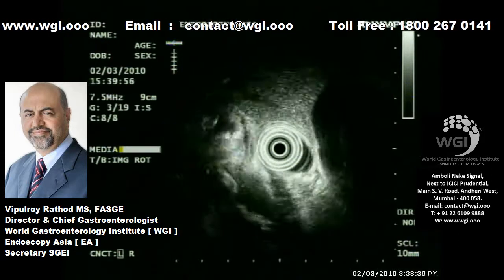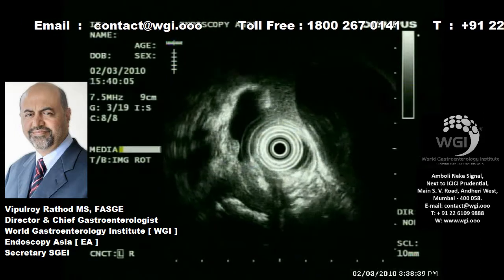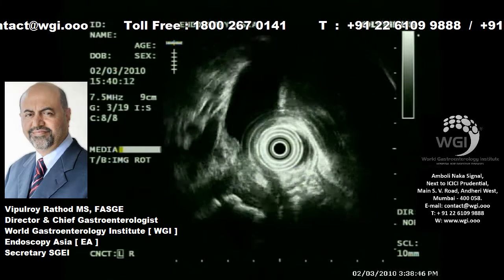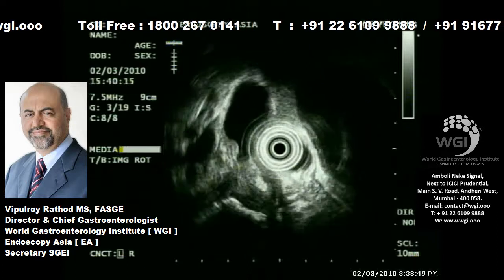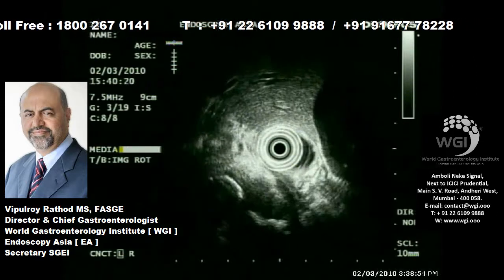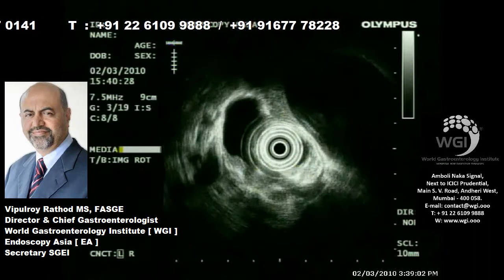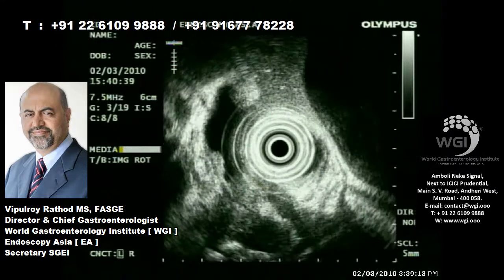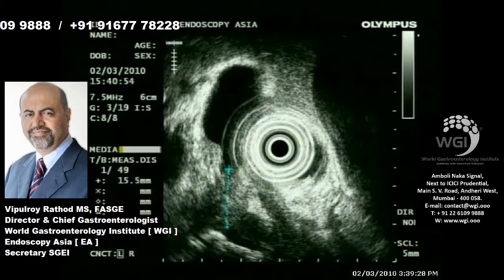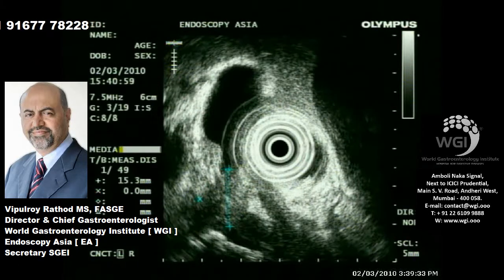Our scope is positioned at the junction of the D1/D2. You can see the bile duct dilated, and you can see multiple hypoechoic nodes and an irregular stricture of the CBD in the intra-pancreatic portion, with a large dilated pancreatic duct and stones in the pancreatic duct. We are measuring a hypoechoic area seen in the setting of chronic pancreatitis.